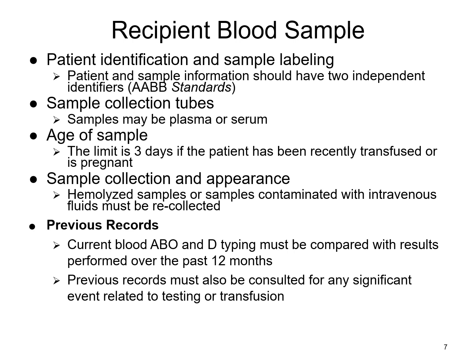And your samples that are old, so if you're holding on to a sample, let's just say a patient was doing a pre-surgical workup and the sample was collected a few days in advance of that surgery.